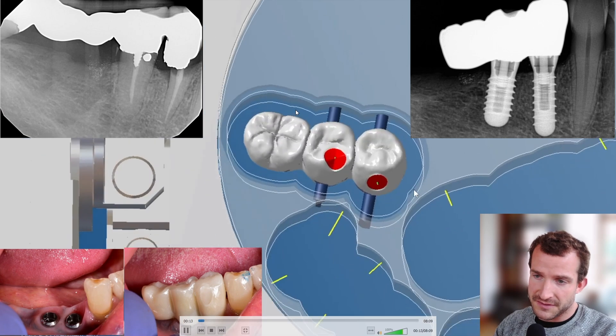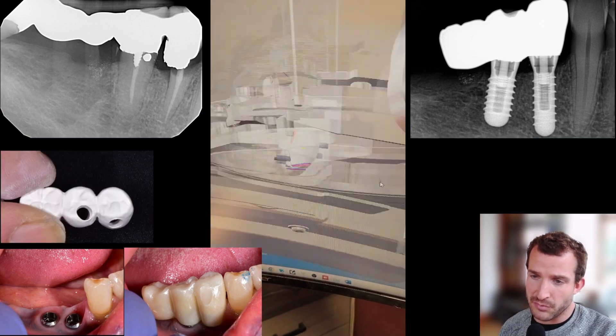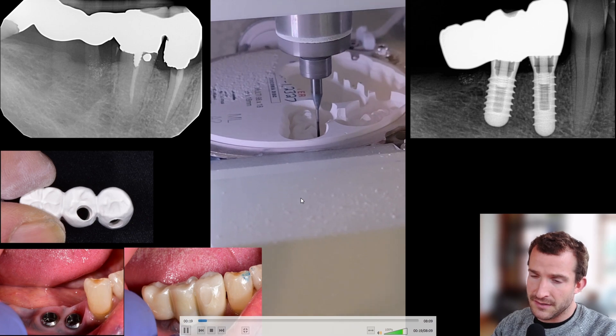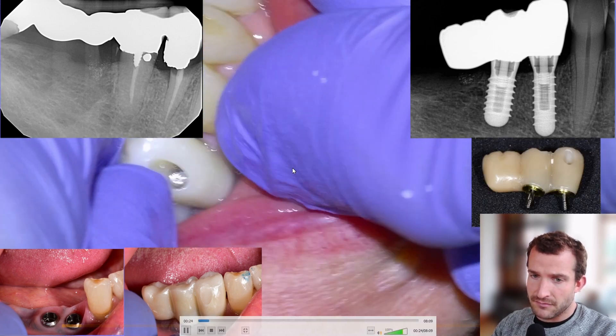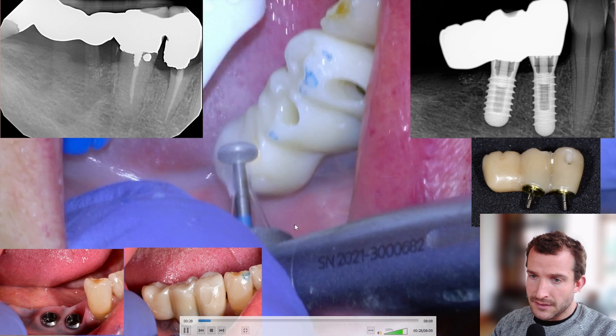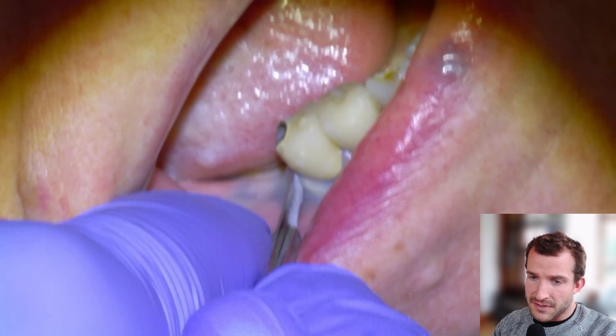My designer Pargiv is going to design this unit and we're just going to plug it into the Roland, mill it out like so, center it, polish it, bond the adapters, install, adjust the bite, fill up the screw channels, and give it a polish.